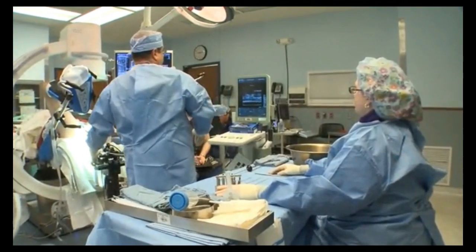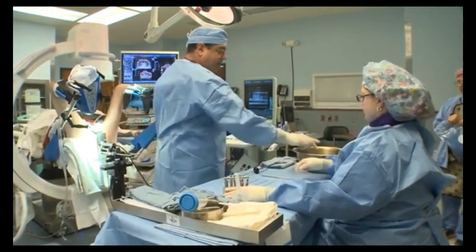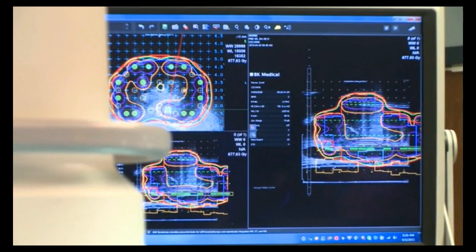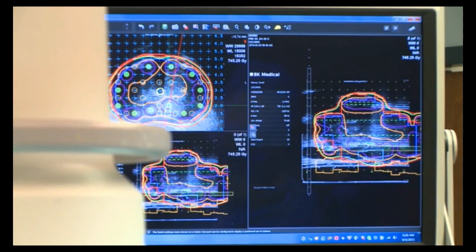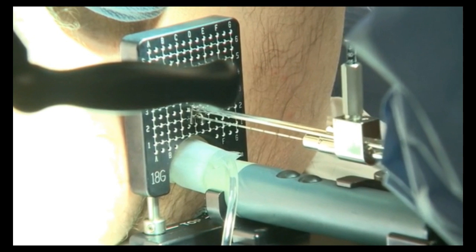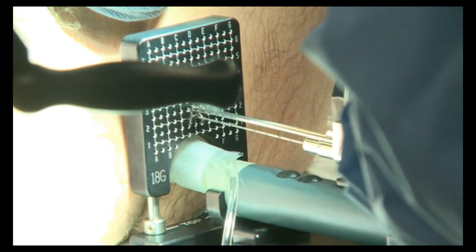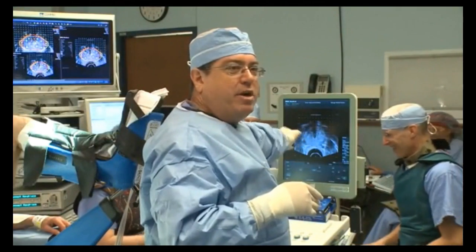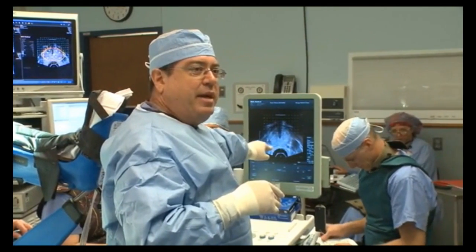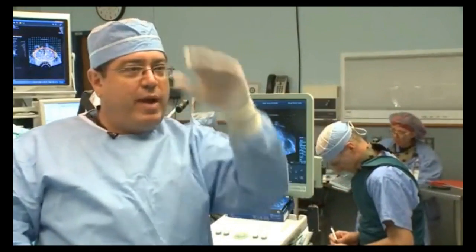So the top one — let's take big dog 2 as our first needle. Bill, do you want to print everything off? I'll start getting ready. I look like I'm below the urethra. I can take the needle tip on up to the top of the prostate. That looks like I'm all the way to the top. Now I take the sharp piece out. I'm going to pull back here and go three in a row. And you can see Bill pushing those seeds to the right spot. As you place the needles, you're going to get a little bit of swelling and imaging. If I went bottom to top, by the time I got up here it would be hard to see my image. If I start up here at the top and work my way down, I've still got good image at the bottom.